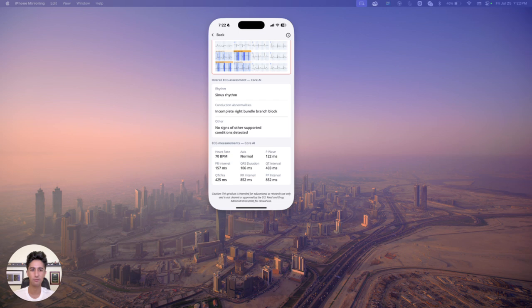Other than that, it's used in many countries, and I know they have many university partnerships, in the US included. So really cool tool. Another thing that I think, definitely in the next few years, is that this is probably going to be integrated into the actual EKG machines that we use, and those reads that we get at the top will probably be more accurate. We all get those EKGs where it says STEMI and you're like, yeah, that's not a STEMI, and you sign it as no STEMI. Hopefully some of those will be more accurate.